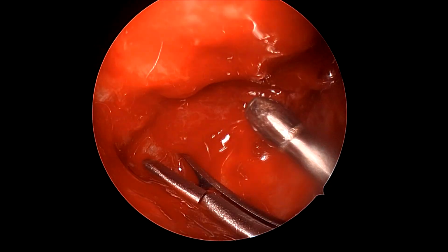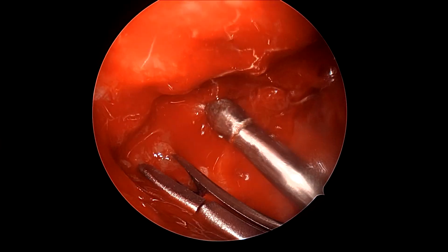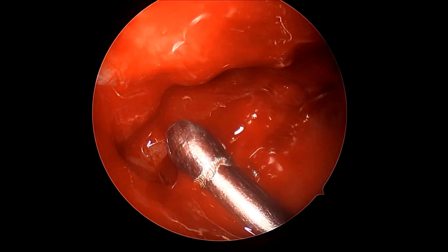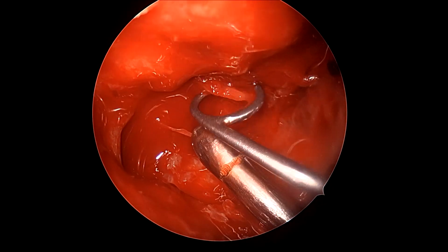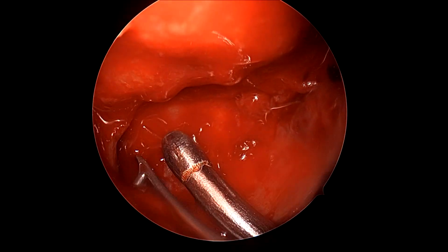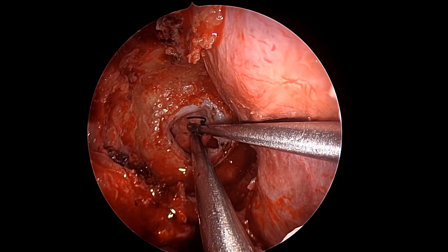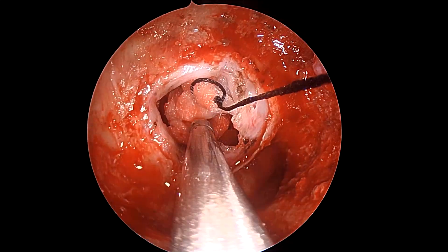So these angled endoscopes can be turned on both sides, and now you see how tumor remnants on the lateral inferior part of the sellar wall are being carefully visualized and removed using an angled ring curette, with the suction in place to maintain visualization and to remove this. And that is the beauty of the angled endoscopes, because they can manage this step very well.